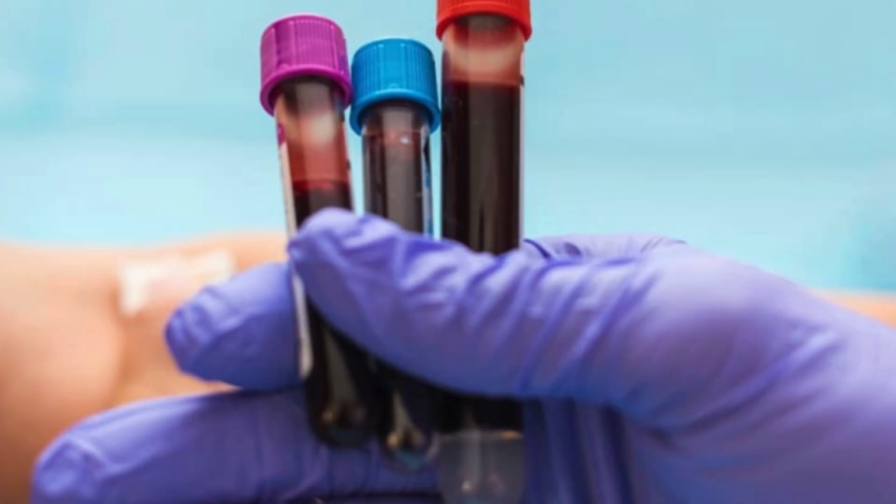So today I am going to speak about the order of draw of the tubes that we use in the lab, or the tubes that we use as a phlebotomist. The order of draw is yellow, blue, red, green, lavender, and gray. But today I'm going to mostly speak about the lavender, gray, red, and blue.